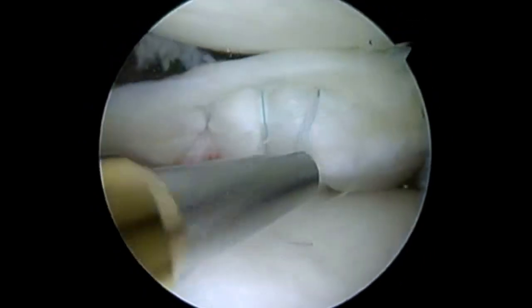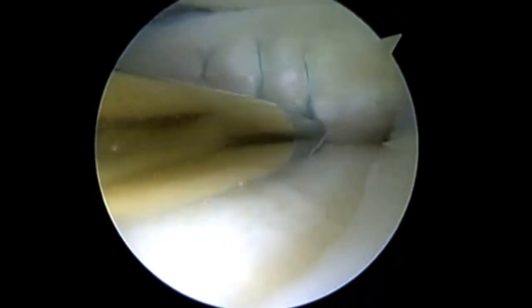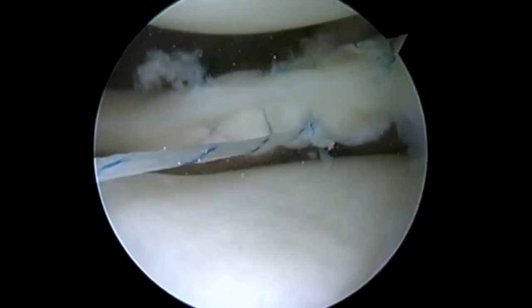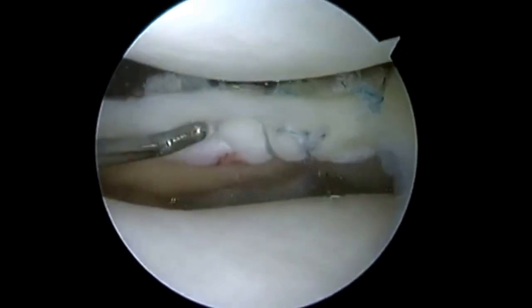The only difference here is now my loop's on top and my knot's going to be underneath, and I just tie this in standard fashion. I get an excellent approximation of this complex lateral meniscus tear. Once we've got our knot secured, we use the knot pusher suture cutter to cut our tails, and I just cut them one at a time — I'll cut the post limb, then I'll cut the other limb. You can see we have a nice anatomic repair of a complex tear of our lateral meniscus, and that's why I prefer a circumferential stitch versus a meniscal fixator type device.